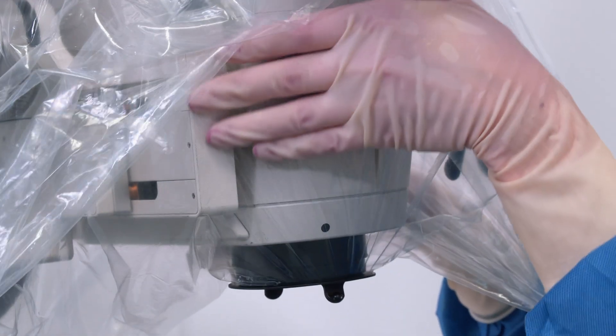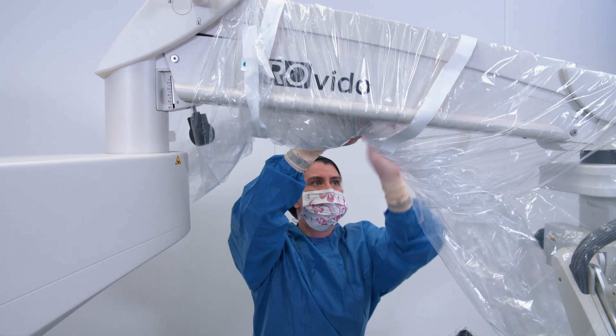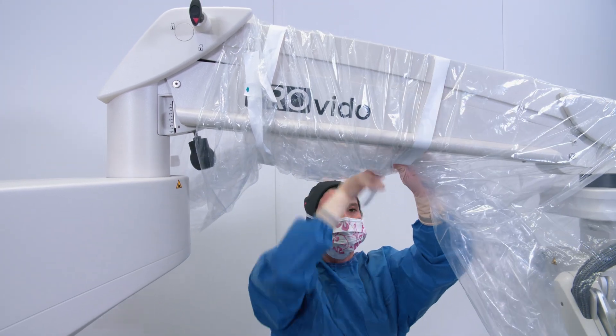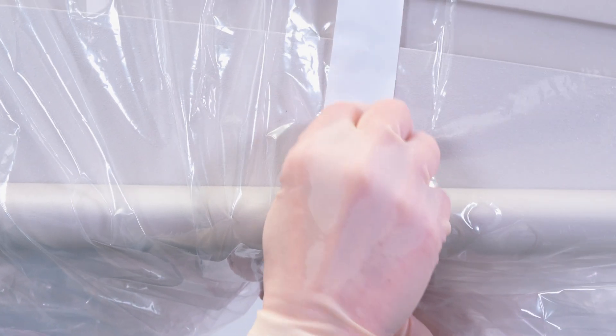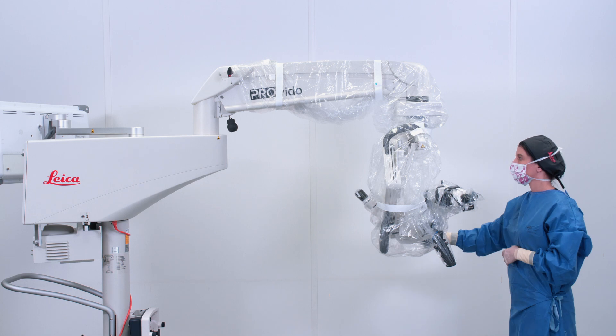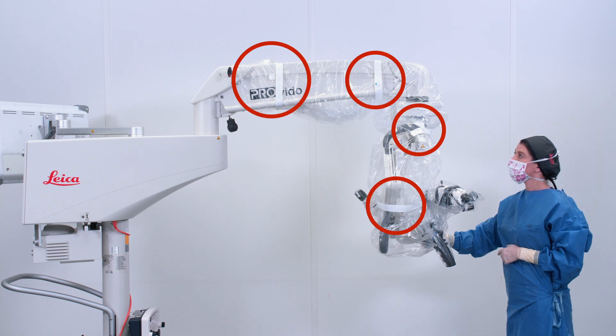Make sure the drape is not covering the lens. Wrap the bands around the microscope head and arm, placing them tape to tape and not tape to plastic, and making sure the drape is fitted to the microscope. Check that the straps are attached around the microscope head and around the arm as shown in the images.